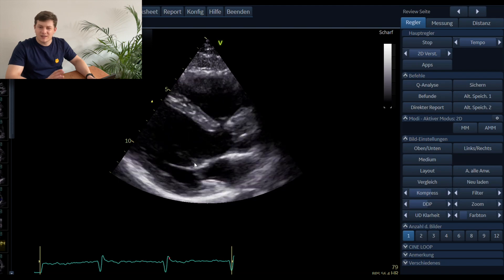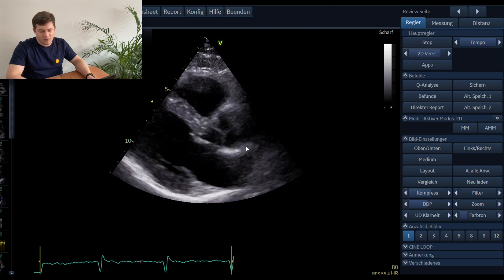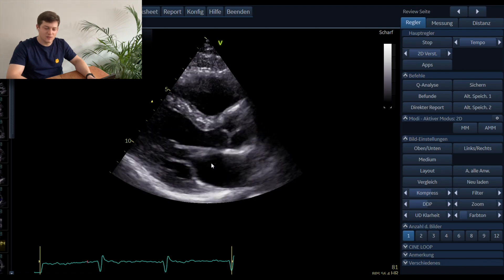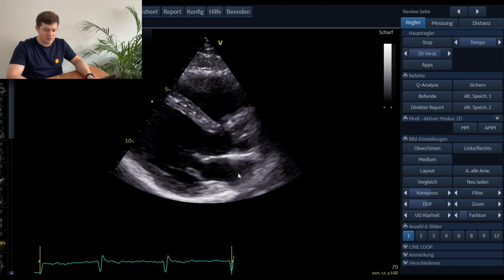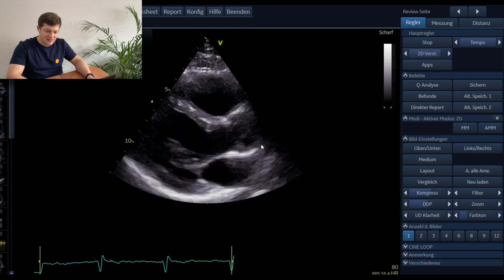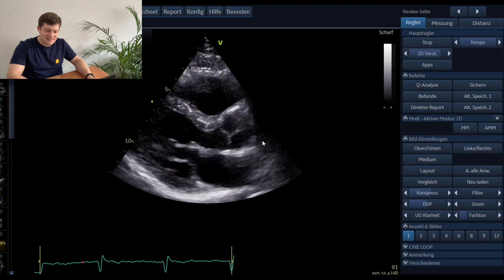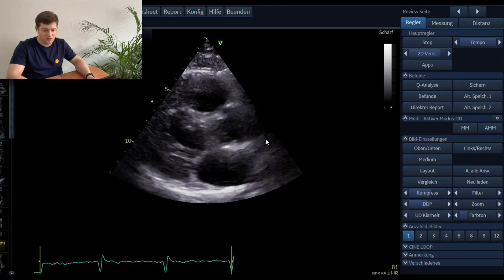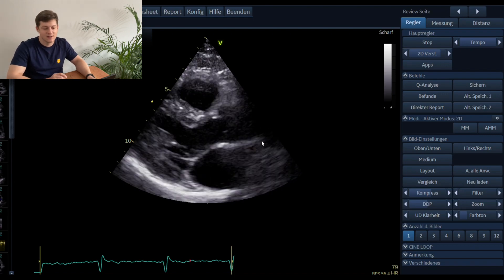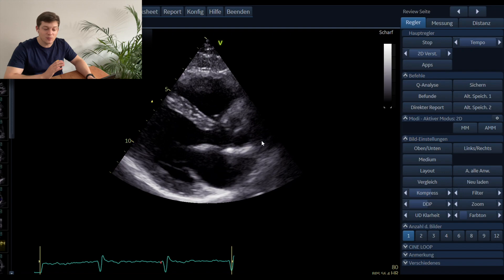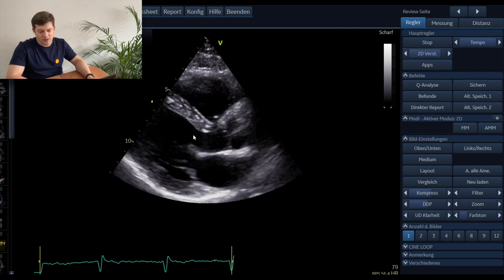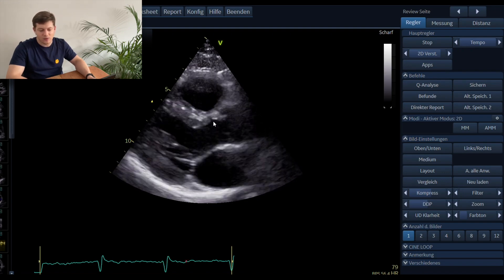We are not done with the anatomy, because here we have another cavity — this is the left atrium. And even here you can appreciate a vessel entering the left atrium, so it has to be a pulmonary vein. Even in a parasternal long axis view you can already see the pulmonary veins.